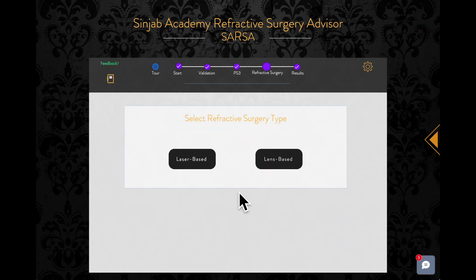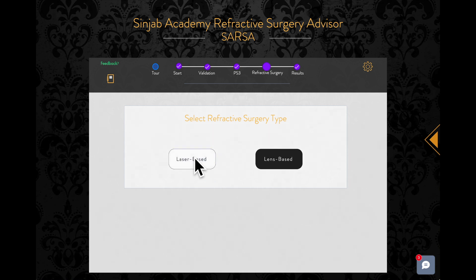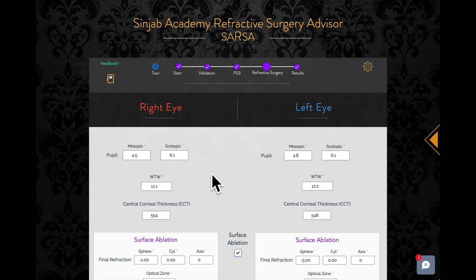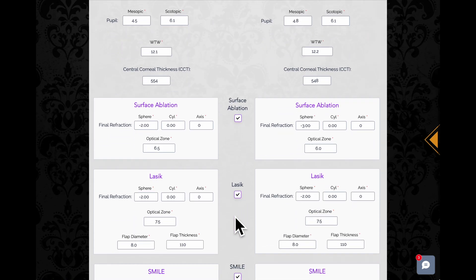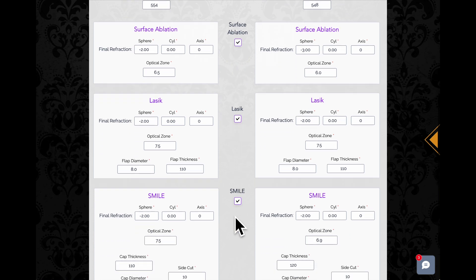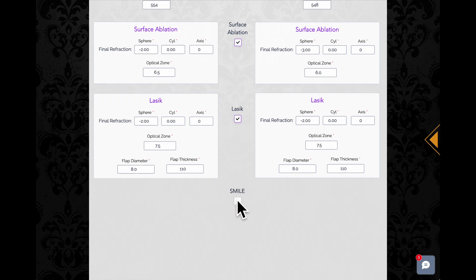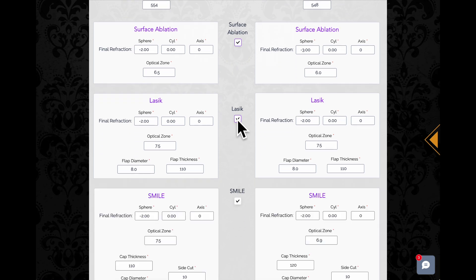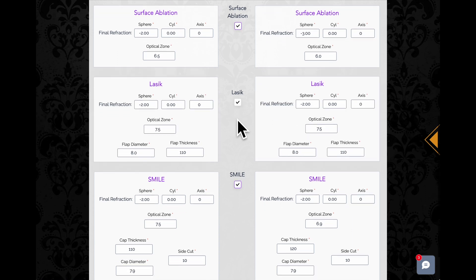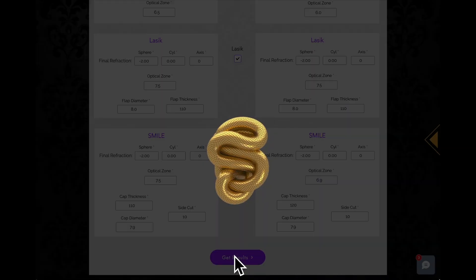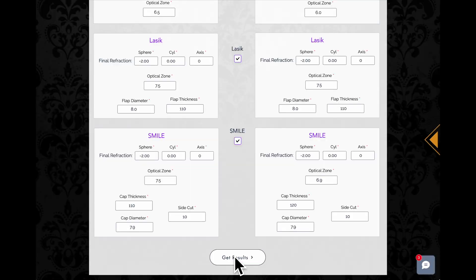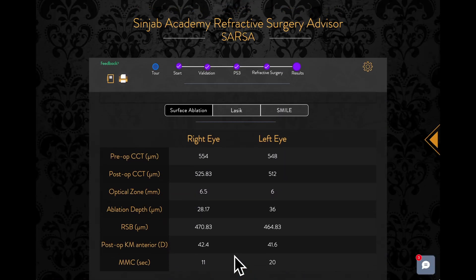In the refractive surgery step, select the type of refractive surgery you are planning to do. Under each type, all subtypes are checked by default. You can uncheck the subtypes you wish to exclude from the processing. After filling the blanks, click get results to let Sarsa process the data and present the results and recommendations.